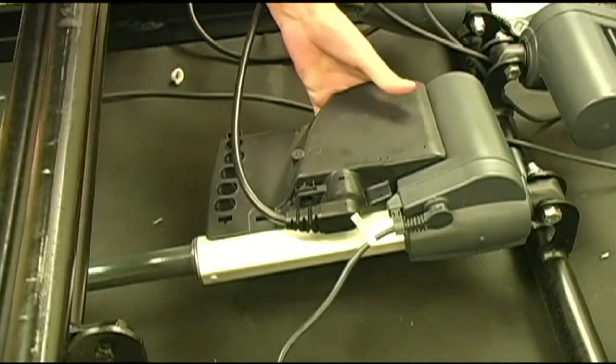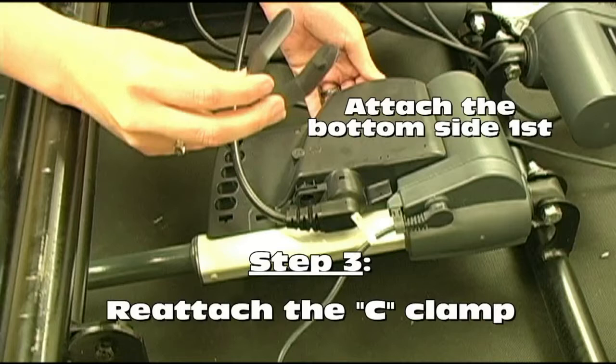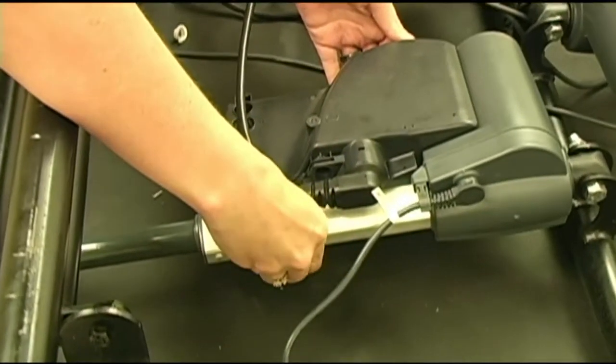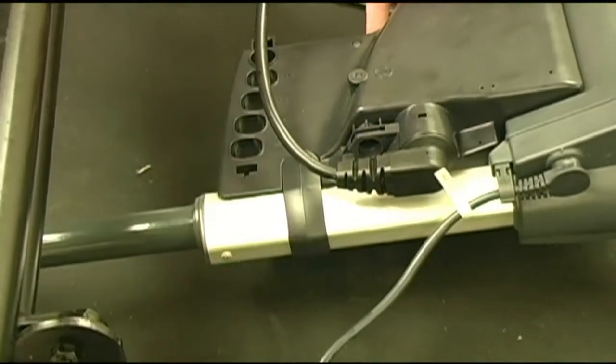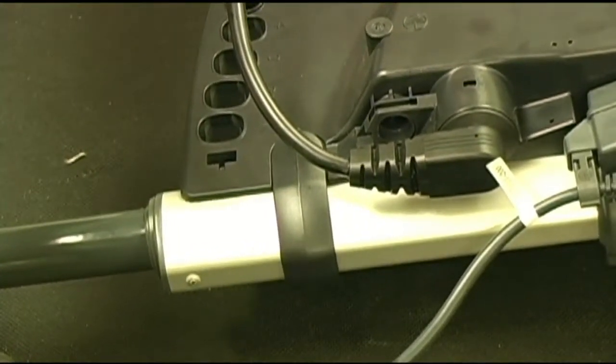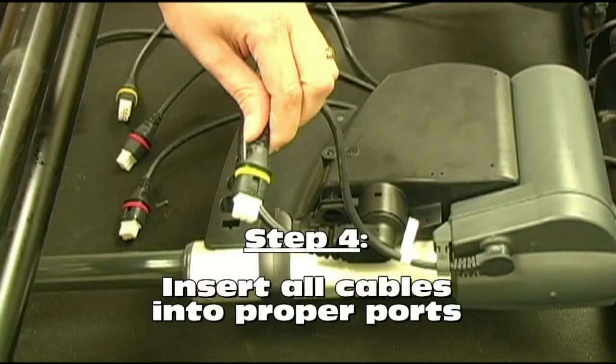In order to secure the control box to the head motor, reattach the C-clamp to the top and bottom of the control box. Using your hand, attach the bottom side first and then the top. You should hear the clamp snap into place when positioned correctly. Once the control box has been properly secured with the C-clamp, you can now reinsert all cables into the proper ports on the control box.